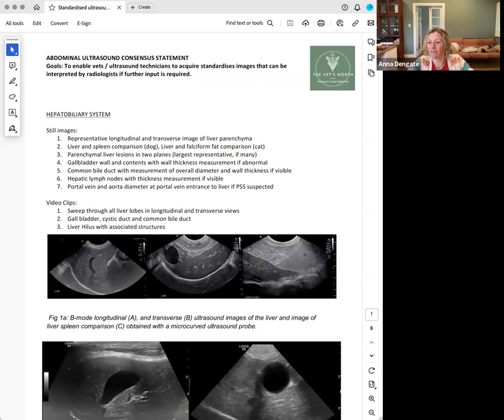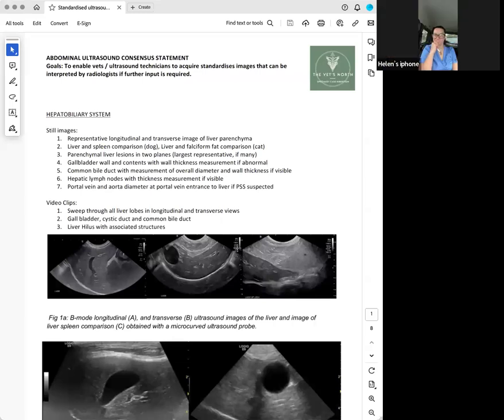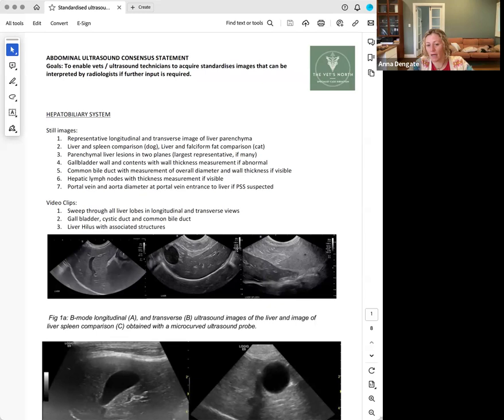And it's pretty rough. Sometimes you get a really good impression of a big liver, but ultrasound is subjective in liver size, as are all of the modalities of assessing liver size. But you can get an impression relative to the ribs. If you have to angle a lot, it might be a bit small. If you don't have to angle at all to assess the liver, then it could be a little bit enlarged.